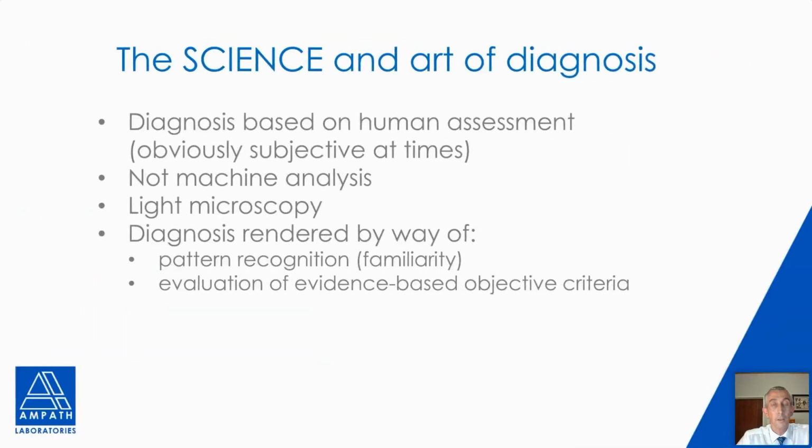Concerning the science of rendering a diagnosis. As I have already mentioned, it is based on human assessment, which is obviously subjective at times, not machine analysis. We do this by way of light microscopy. And we render the diagnosis by way of pattern recognition. In other words, we have seen this before and we know what it is. Or we have to evaluate using evidence-based objective criteria.